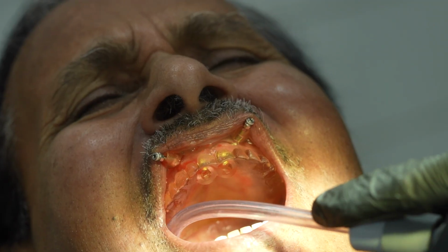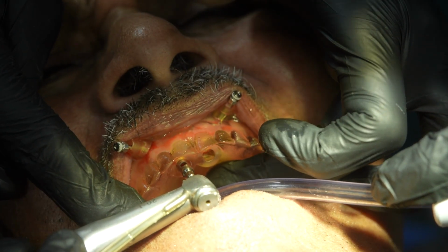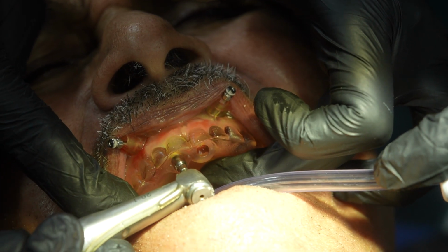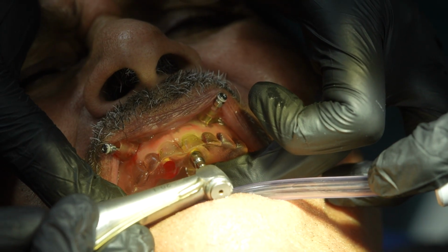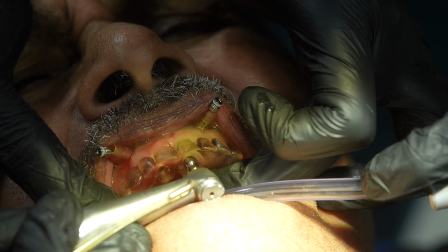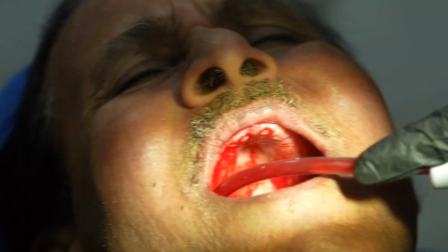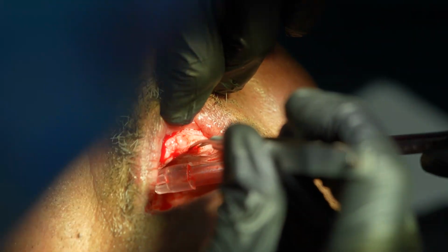Now we will start with the tissue punch. We are doing this to remove the tissue.